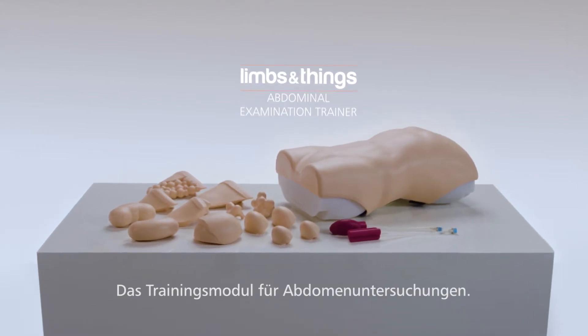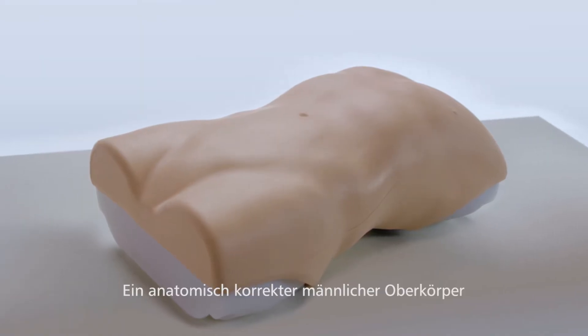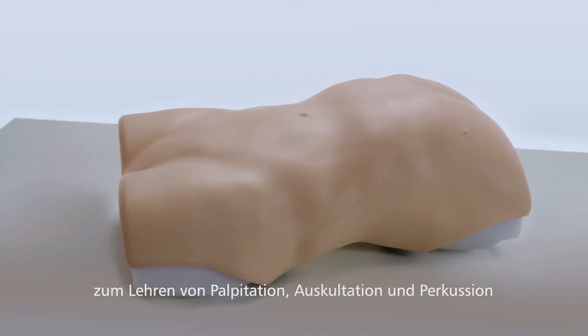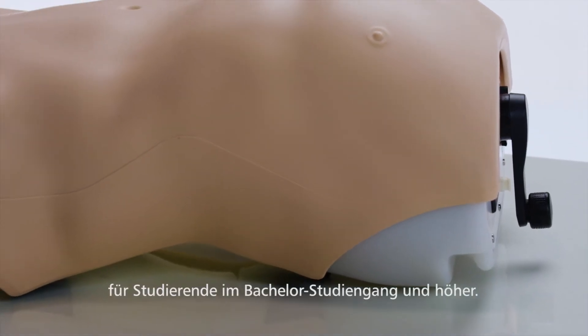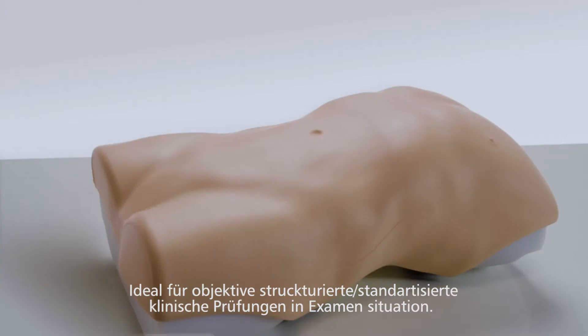This is the Limbs and Things Abdominal Examination Trainer, an anatomically accurate adult male torso for teaching the key skills of palpation, auscultation and percussion to undergraduate medical students and upwards. It is an ideal tool for OSCE use.